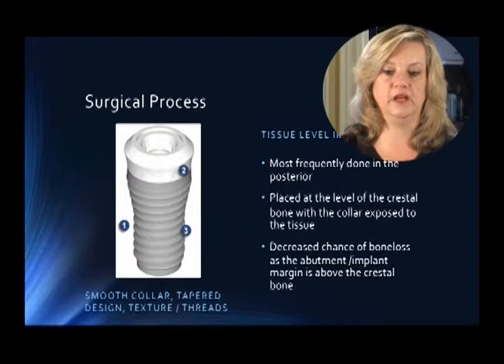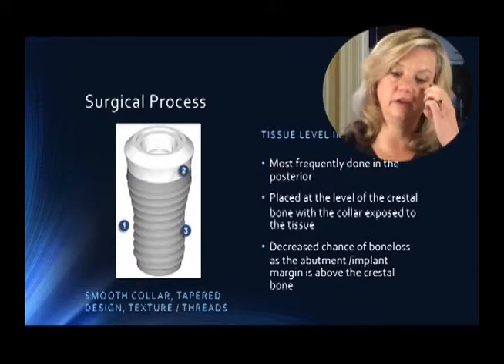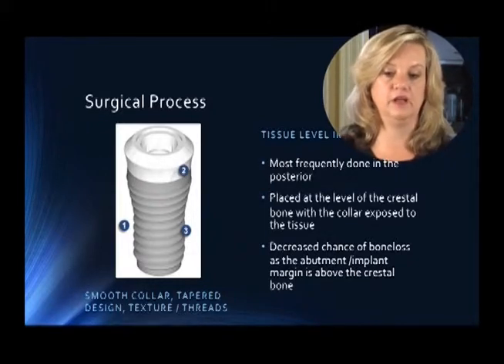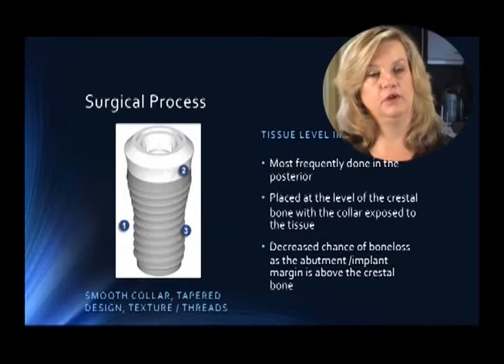So these are placed at the level of the crestal bone, the crestal edge, with the collar exposed through the tissue. And there seems to be a decreased chance for bone loss around these because, of course, everything is at the crest of the bone. It seems to be a little bit safer if you're dealing with cement.